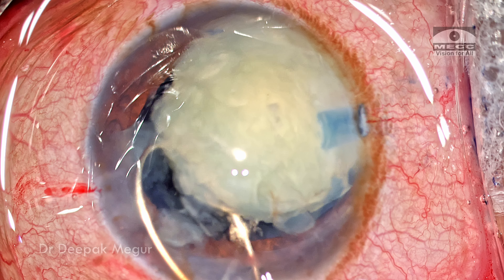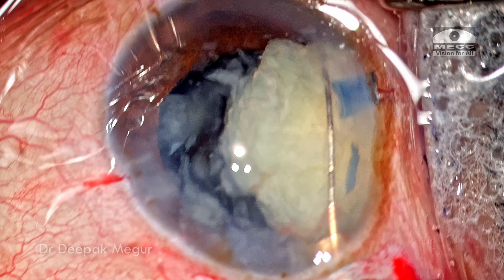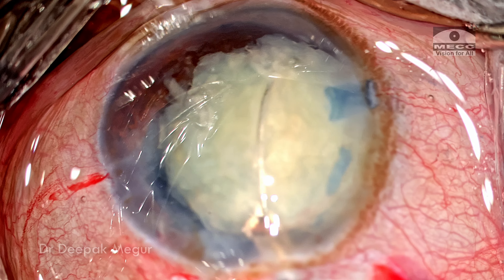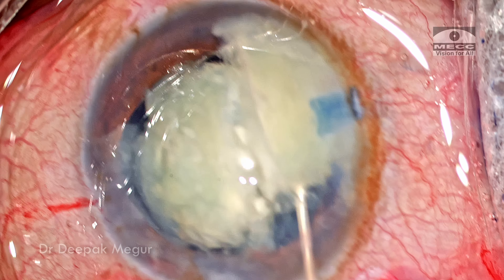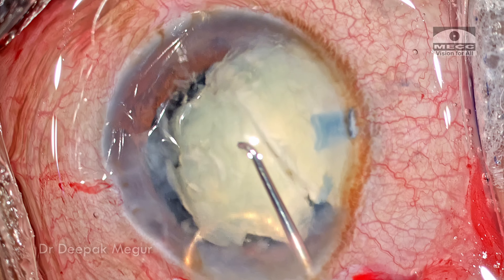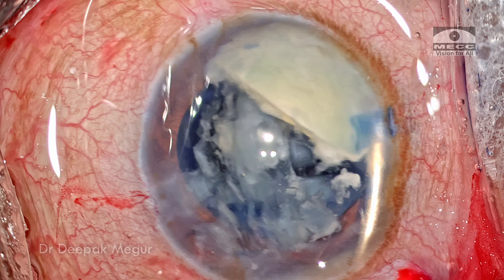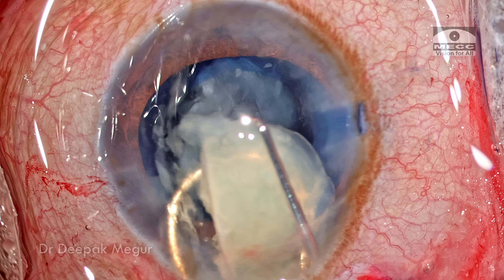To conclude, the snare is a very effective way to bisect the nucleus and doesn't have a very long learning curve. It adds tremendous value in giving better uncorrected visual acuity because the incision required to bring out the cut pieces is significantly smaller. If you combine this with a temporal incision, the results are going to be very much comparable to that of phacoemulsification. Thank you for your attention and I hope you found this helpful.